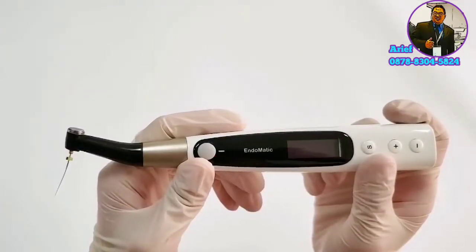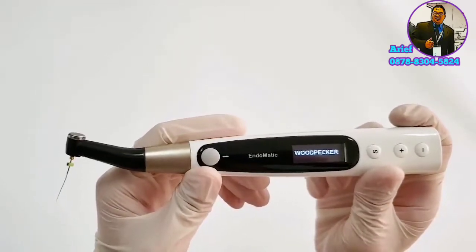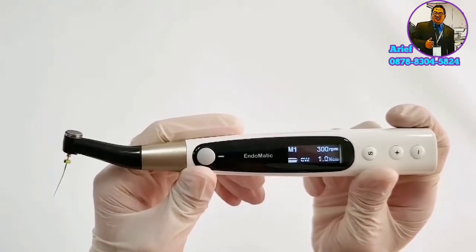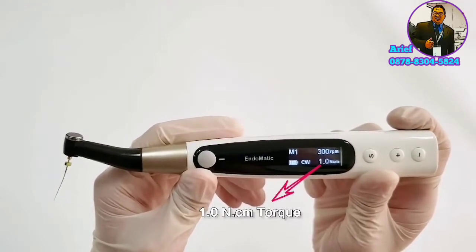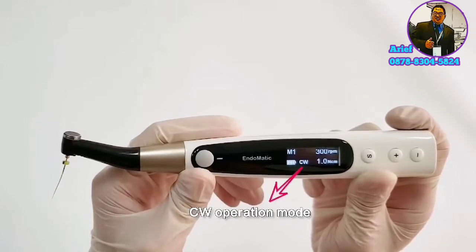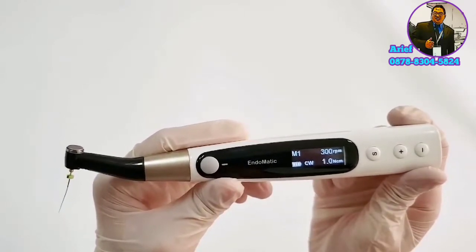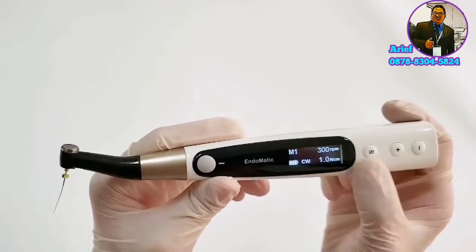For Endomatic, press the power button to start up the device. Please look at the screen — there are 5 display parameters: M1 stands for program, 300 RPM stands for speed, 1.0N stands for torque, CW stands for operation mode, and this icon shows the battery usage.